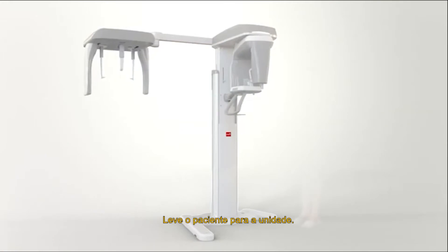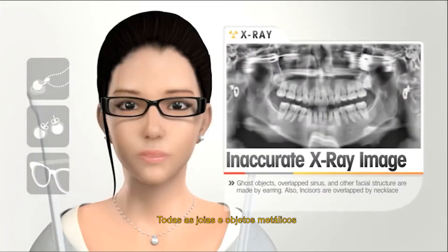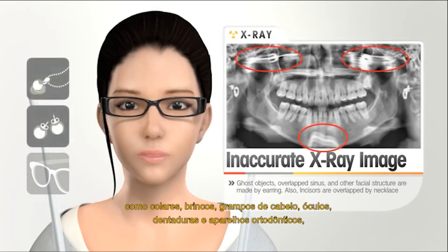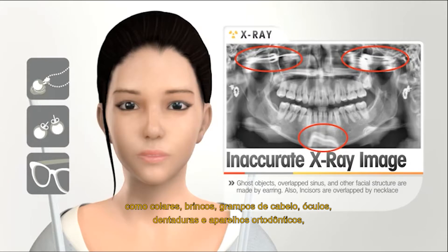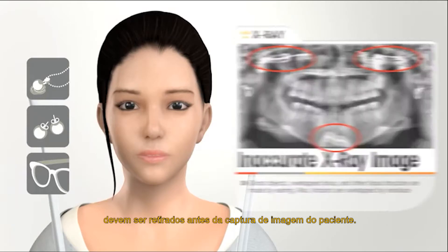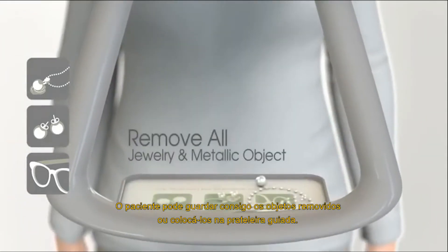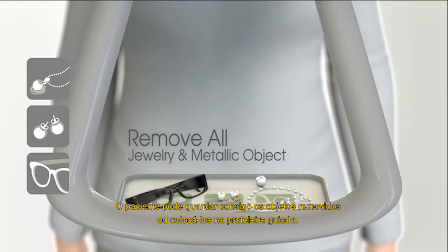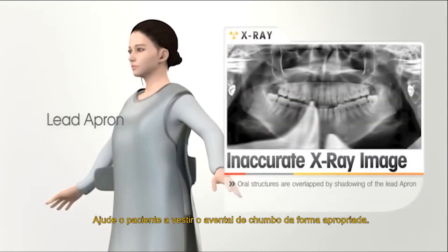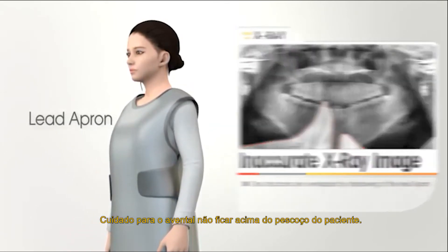Guide the patient to the unit. All jewelry and metallic objects such as necklaces, earrings, hairpins, eyeglasses, dentures and orthodontic appliances should be removed before patient image capturing. The patient can keep their removed jewelry personally or place them on the guided shelf. Assist the patient to appropriately wear the lead apron, being careful that the lead apron is not above the patient's neck.